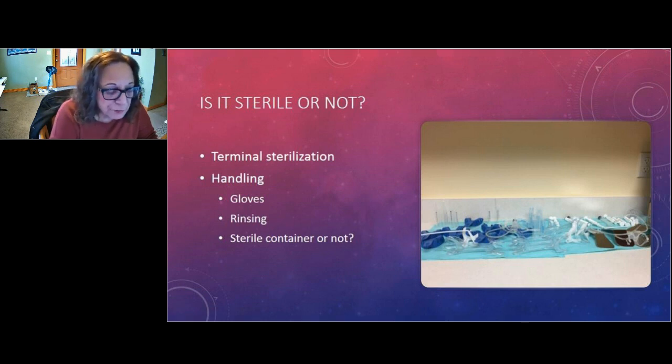I realize that for instrument sterilization, when you hand wash instruments that are going to be sterilized, the true recommendation has to do with water quality, to use RO, DI, or distilled water for rinsing, but there is no equivalent recommendation for high-level disinfection or cold chemical sterilization rinsing.